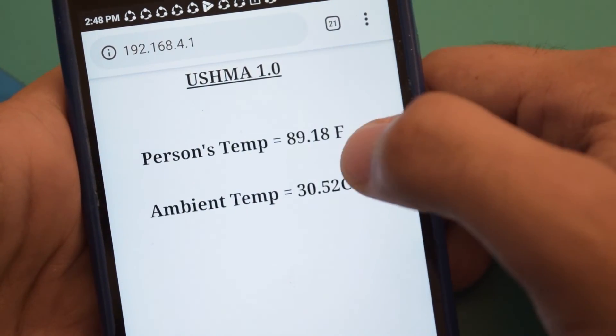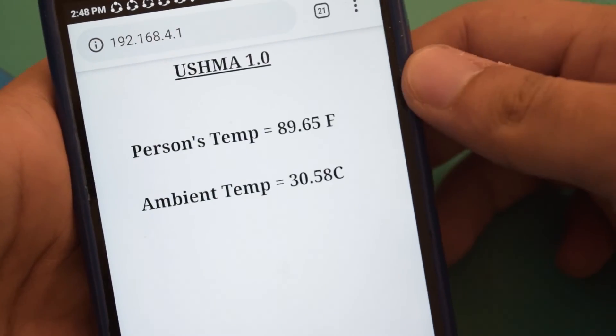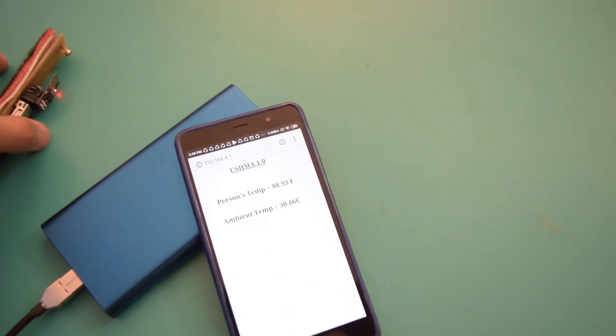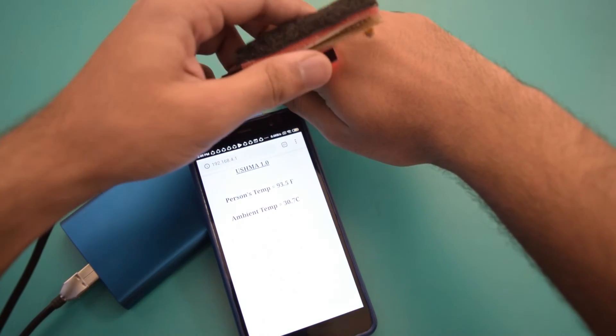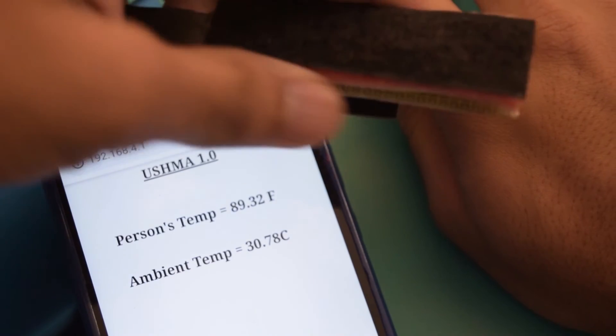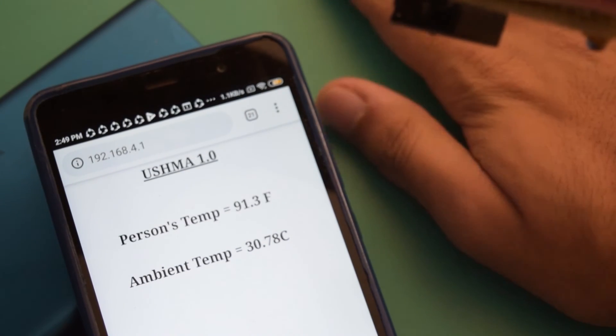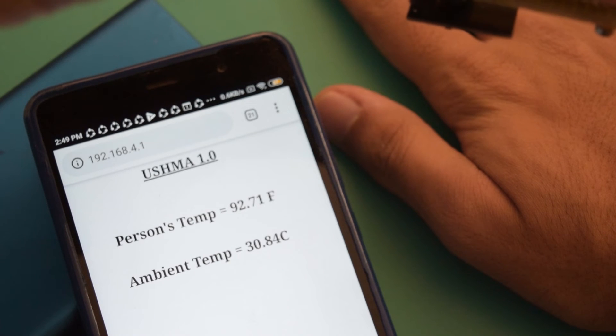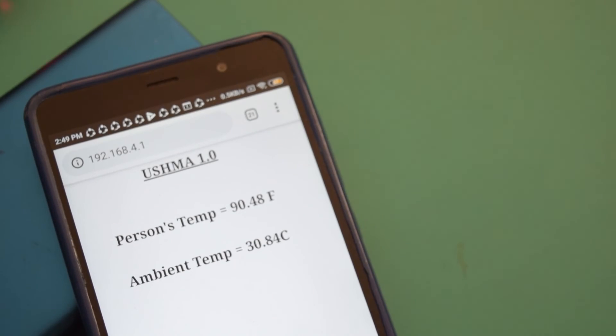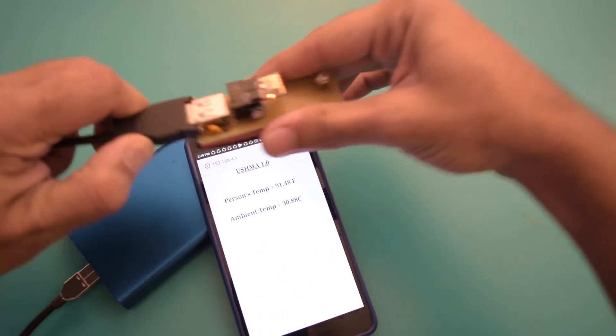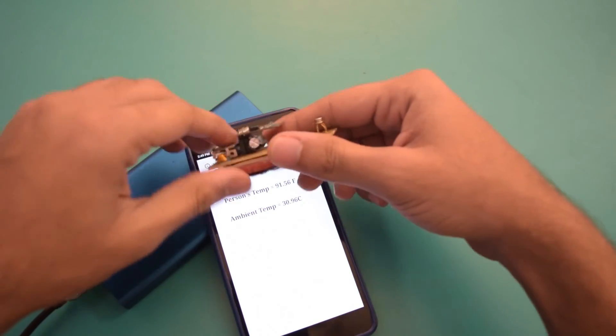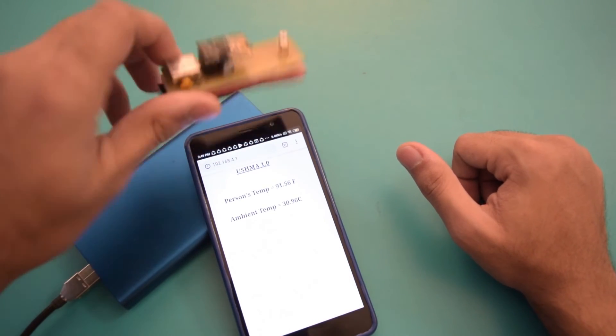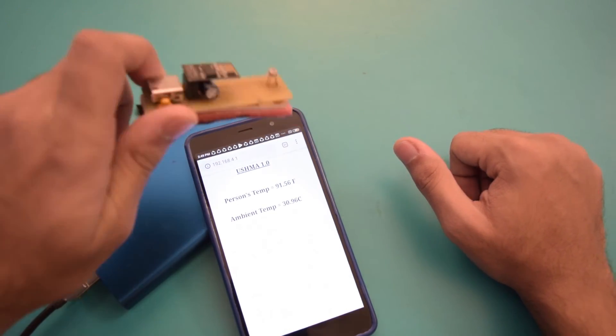I refresh the page and there you go, the values are getting updated. See, in the same manner I'm taking my skin temperature. So you can see when I touch it or not even touch, when it's near the skin, you can see the skin temperature is about 92.71 Fahrenheit. So this is how you can use this particular thermometer. You can keep it in the pocket, you can carry it anywhere, you can carry it with the smartphone or power bank. So it's a very handy option.